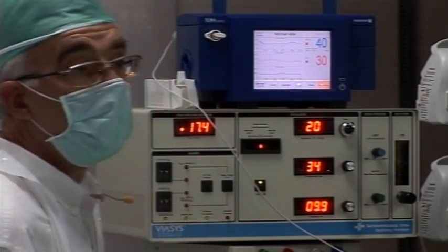So, as we have a full-term neonate, we suspect that it's going to produce surfactant and its compliance is going to keep improving. So I proactively decrease my CDP to wean down my baby. Okay, so let's go down to 16.